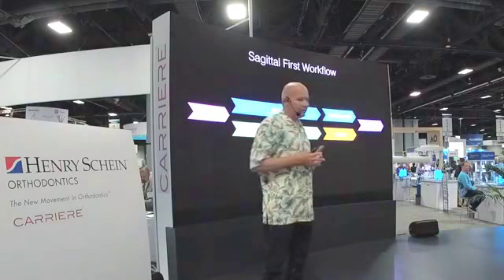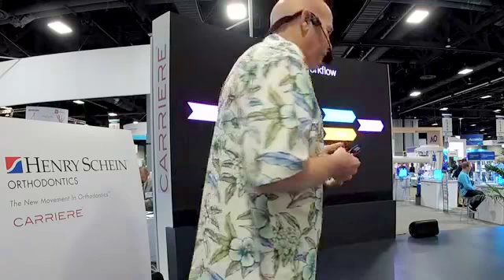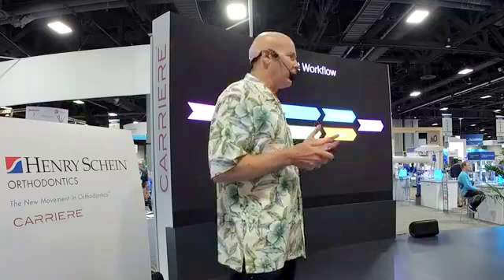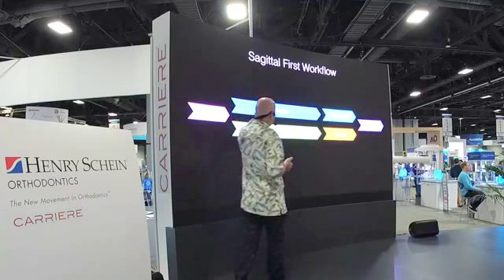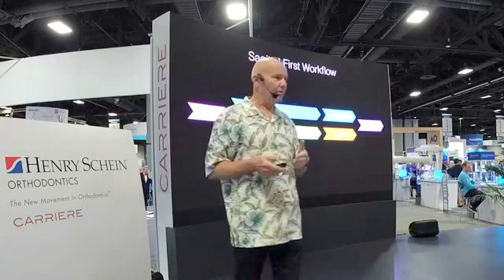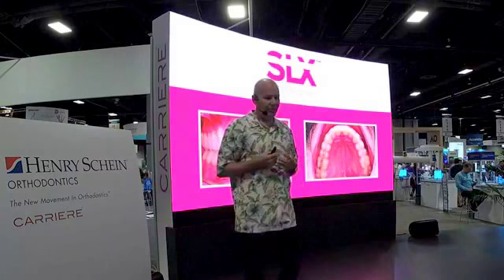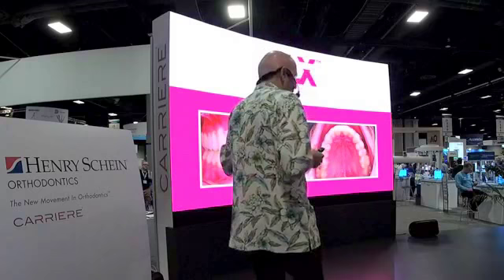The other thing that we can do is maximize the experience of the patient by minimizing the treatment times, and we can use all our digital data to help do that. One of the things that we do in my office is sagittal-first treatment, so that the patient then has an option after we've corrected the AP problem — they can either go to aligners or brackets. Those things are interchangeable, and we have the data set to be able to go directly one way or the other or even combine the two pretty readily.